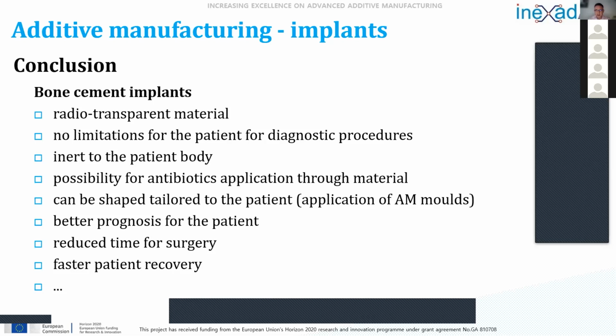So today, after production, the titanium implant will go to CT scanning in order to check if there is something that is not permissible to build into the patient. In earlier times, this was not the case at the beginning of application of those technologies.